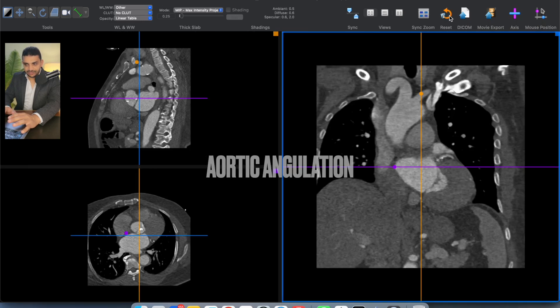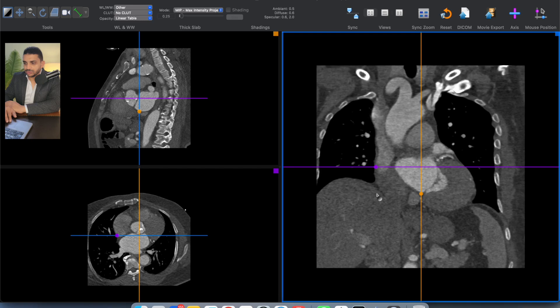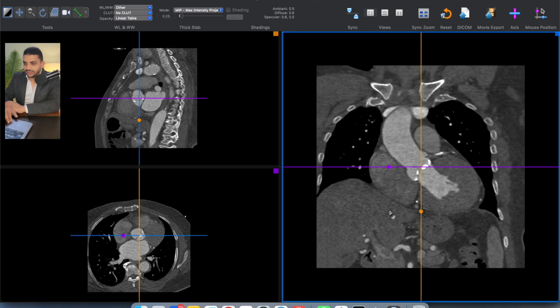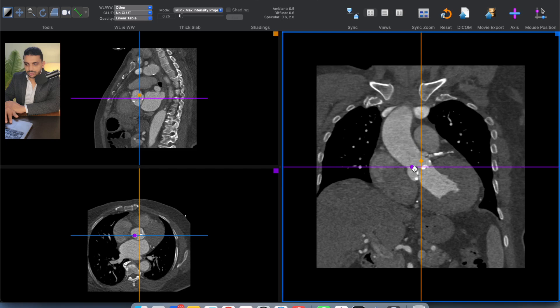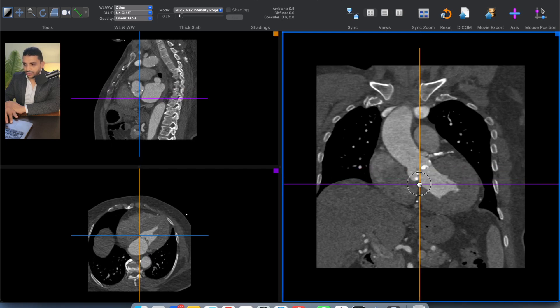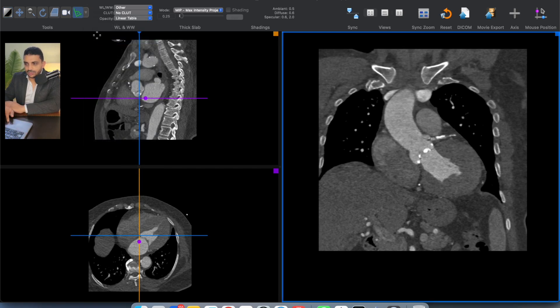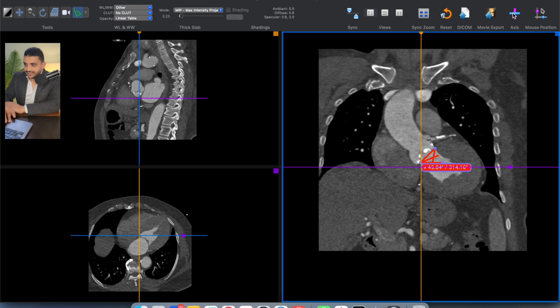We start by resetting everything, then we scroll on the right window — the blue window — scrolling up and down until we find the LVOT, the aortic valve, and the aorta in continuity. Then we go down with the crosshairs and remove the axis. We get the angulation tool from the upper left, then we choose on the right side the cusp that we see — the left coronary cusp and the non-coronary cusp — and then the other line is drawn parallel to the horizon. Here we get an angle of 45 degrees.